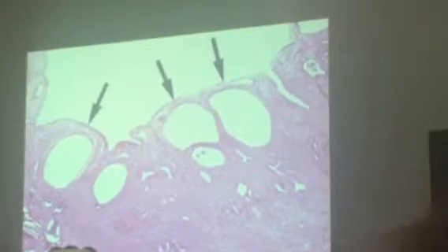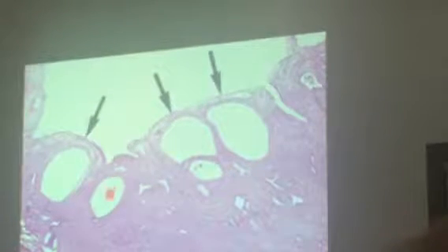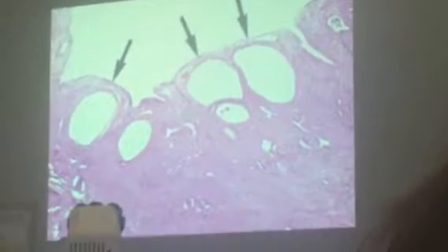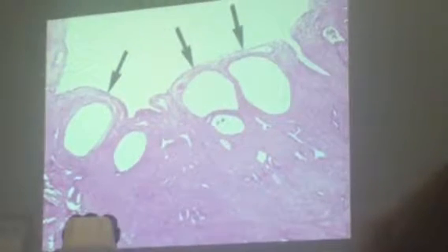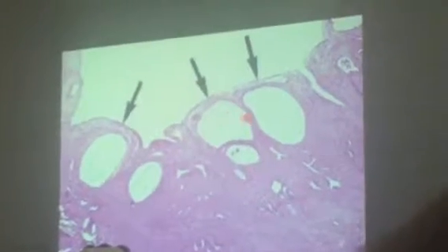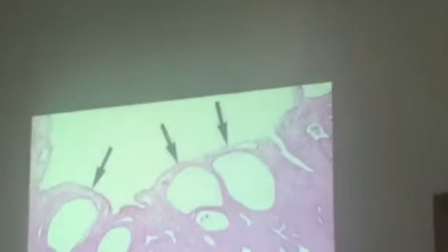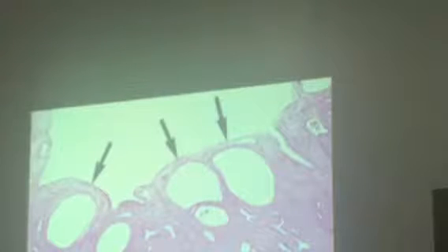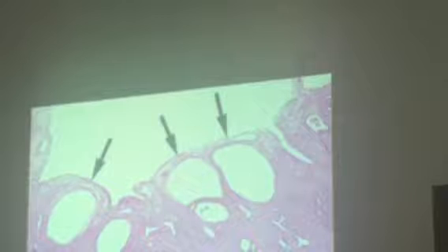Now, this is atrophic endometrium. Nag-atrophy na yung, so nagiging flat or cuboidal yung glandular cells, and the glands themselves become cystically dilated. And you'll notice that the layer of endometrial stroma is very, very thin. Okay, so that is your atrophic endometrium. Any questions at this point before we go to the uterus?